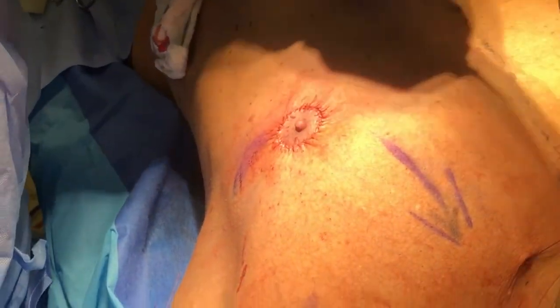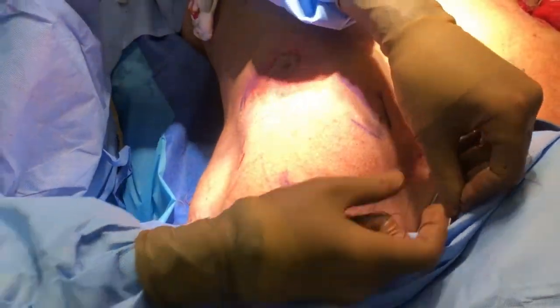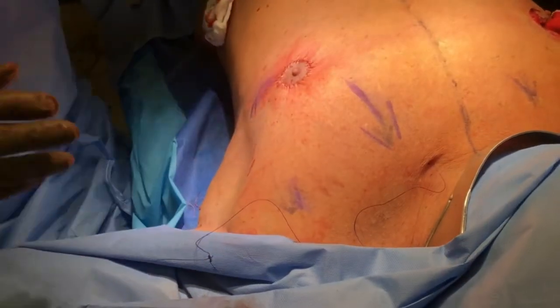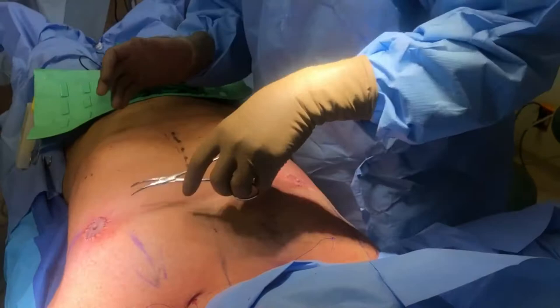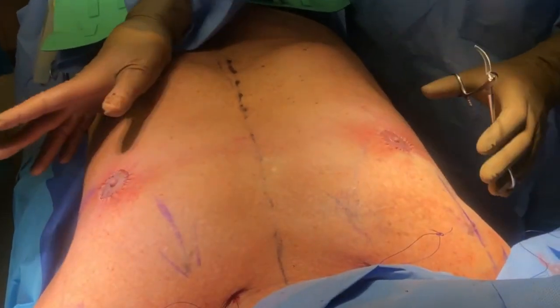We've also already put in our thread lift. So this thread lift is going to lift up the tissues up there. This is a zero PDO coil. Okay, here we are with the final result — nice round areola, nice round, pretty good, equal size.